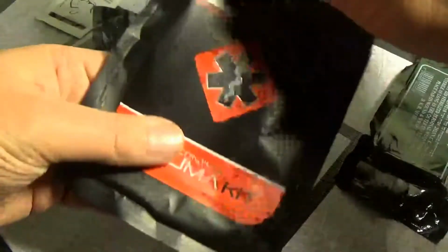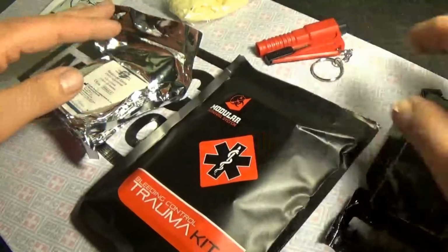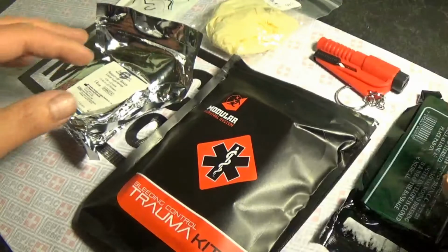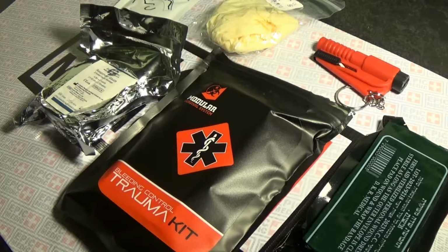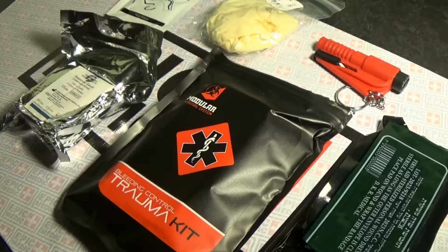And that is it. That is the bleeding control trauma kit, or the module I should say. It has everything you need to help control some very major bleeding. And as I said, the beauty of this kit is it doesn't necessarily require advanced training. All you need is a basic know-how of how to apply correct pressure and a bit of wound packing. So no tourniquets in this kit, but that's not necessarily needed.